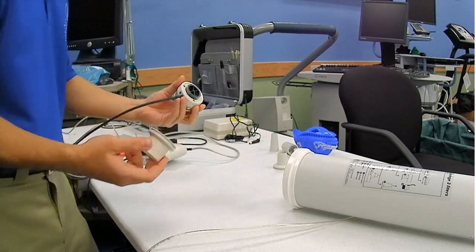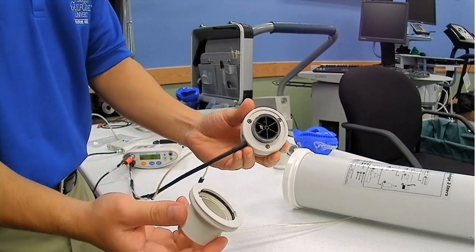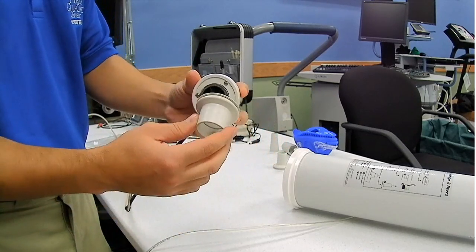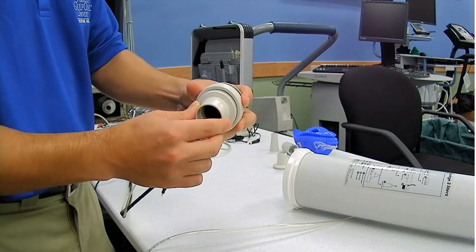Here's a video on how to calibrate the turbine. As you saw earlier, you're going to use the adapter. This adapter is for the 3 liter syringe.